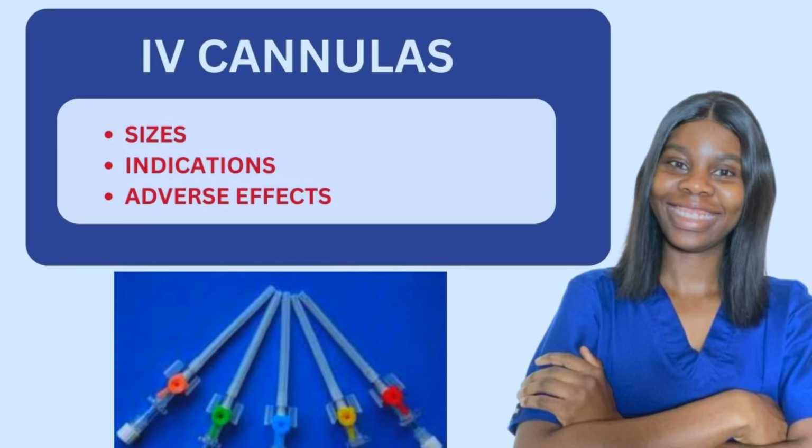On this channel, I talk about nursing and healthcare, and in today's video, I'm going to be talking about intravenous cannulas. I am going to be talking about different types of cannulas, why they are used, as well as the adverse effects of using intravenous cannulas.